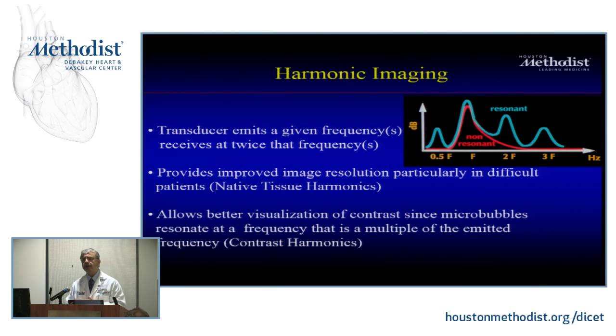You hear about harmonic imaging, and I think it's an everyday practice. If you tell me in ultrasound, what is the thing that has been adopted within probably 2 years, unless you're thinking about how much dollar you want to save, this is one technology. Where, and why? Because it has improved imaging in general, took away artifact, and obviously we can use it for contrast. And so what is it?